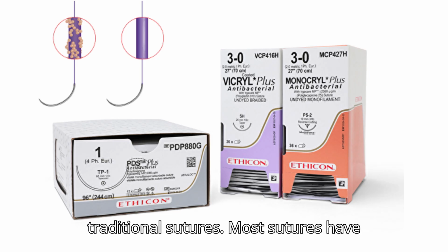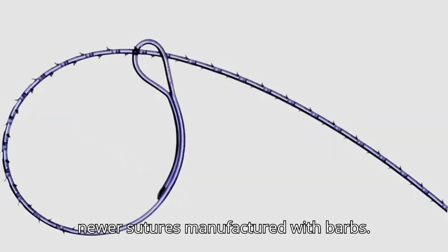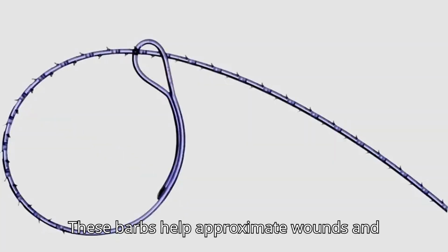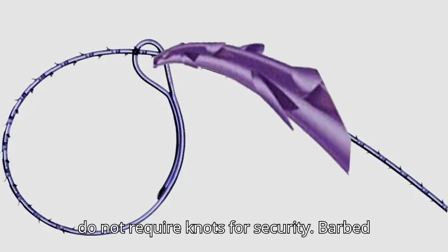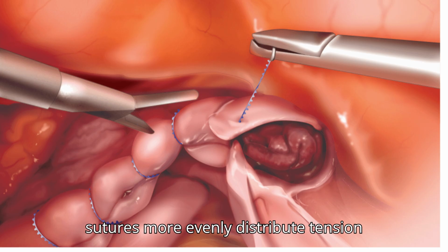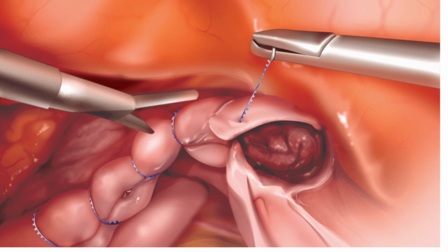Most sutures have smooth surfaces. However, there are newer sutures manufactured with barbs. These barbs help approximate wounds and do not require knots for security. Barbed sutures more evenly distribute tension along the wound. These sutures are also known to be more time efficient.